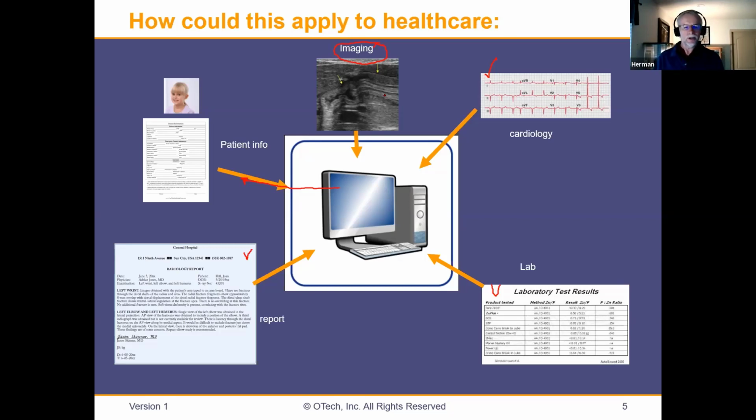So the impact you see is tremendous, because you could create an EMR, electronic medical record, being a shell instead of this big silo and having everything archived in there with the documents and the EKGs and this and that and the database with all the patient information. All of that is just a shell. It's like a web page linking to the resources, including the images, right? So you can see what a big advantage that they have.